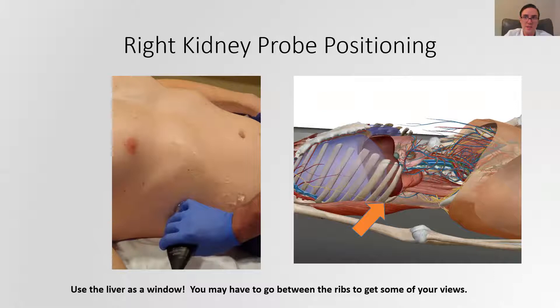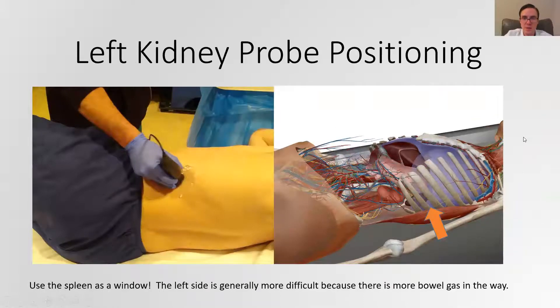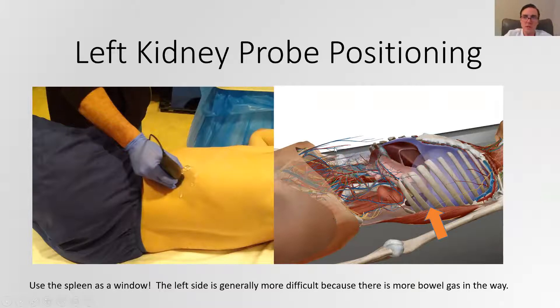Gas pockets are terrible windows because they cause a lot of shadowing, and sound waves just can't get through them very well. When looking at the right kidney, you want to either get under the ribs to look through the liver, or even between the 10th and 11th, or 11th and 12th ribs to find good windows. The left side is a little bit harder because your window is smaller — you have to use the spleen as a window to image that left kidney. Sometimes you have to be more creative in your positioning and have your patient roll up on their side to get the bowel gas out of the way.